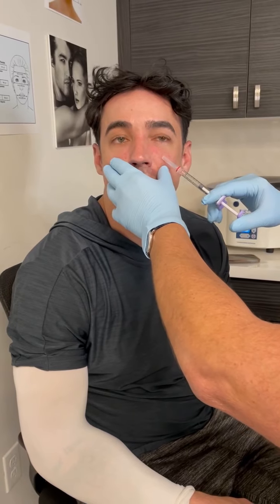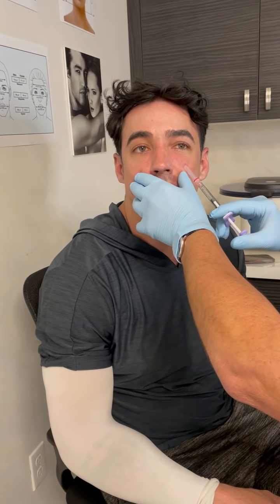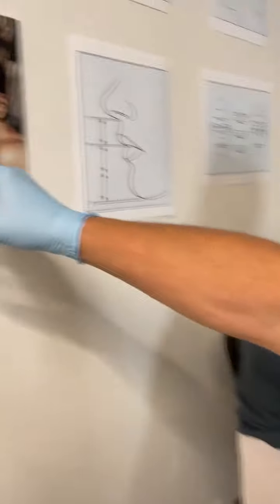And so my handout shows 1 and then 2, which is in the mid-pupillary line. You go in and you fan it, and then you see that beautiful little bump he has, which I just made. You can see the fresh needle marks. This is perfect. This is a nice cheek augmentation using Juvederm. And it has to look natural.